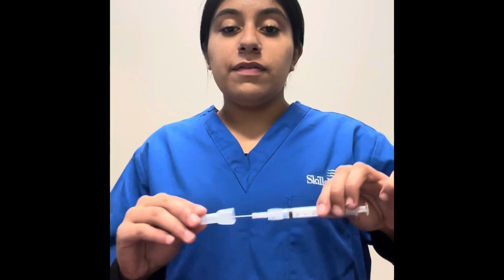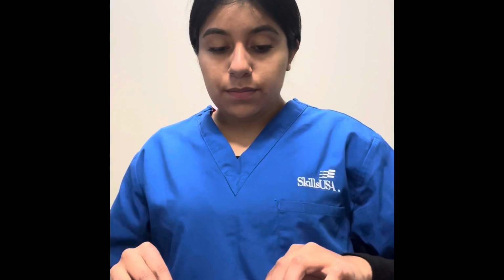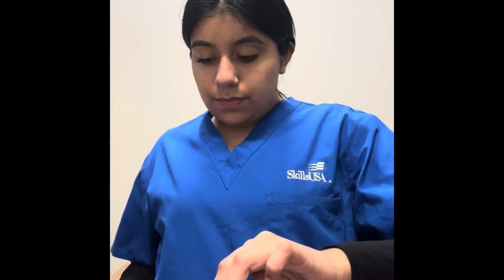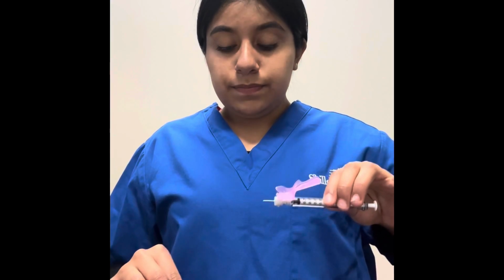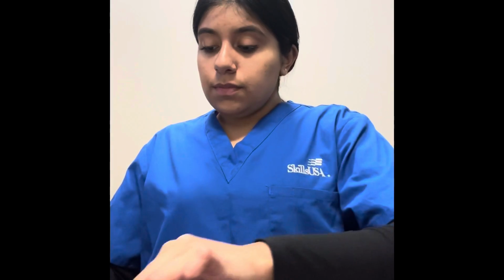Subcutaneous injections range from gauge size 23 to 27. Here I have gauge size 23. Here I have gauge size 25. Here I have gauge size 27. And here I have the insulin needle.